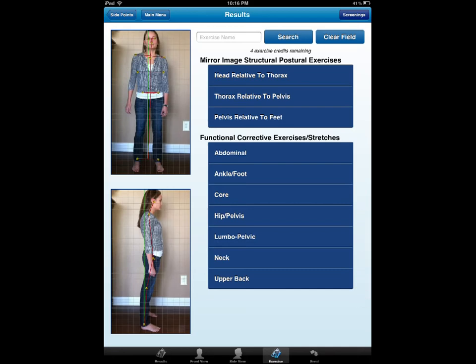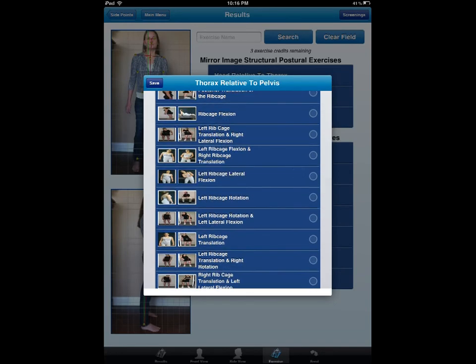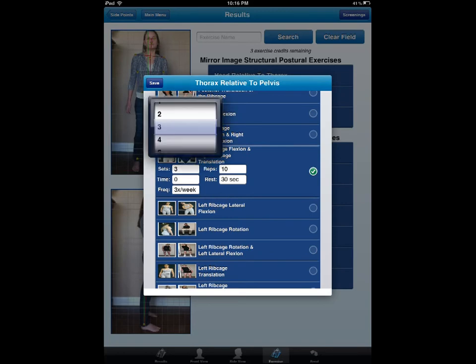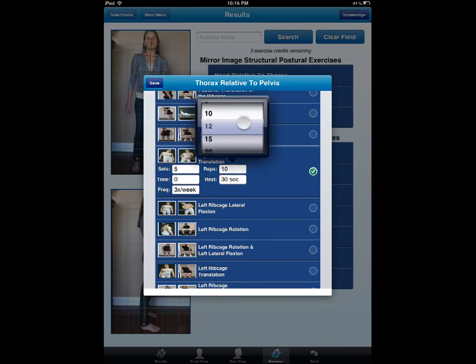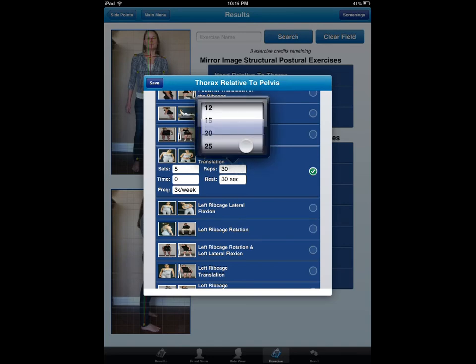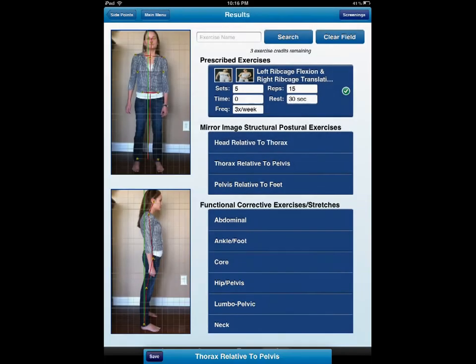Now what is great about this — let's go ahead and start the prescription. We'll go ahead and use a credit. Now let's do the thorax. On the left is the patient's posture; on the right is the corrective exercise. We're going to go ahead and manipulate the sets and reps right on the fly. I'll make her do 15 reps. And for the thorax, that's all I want to prescribe. Notice it shows up at the top.